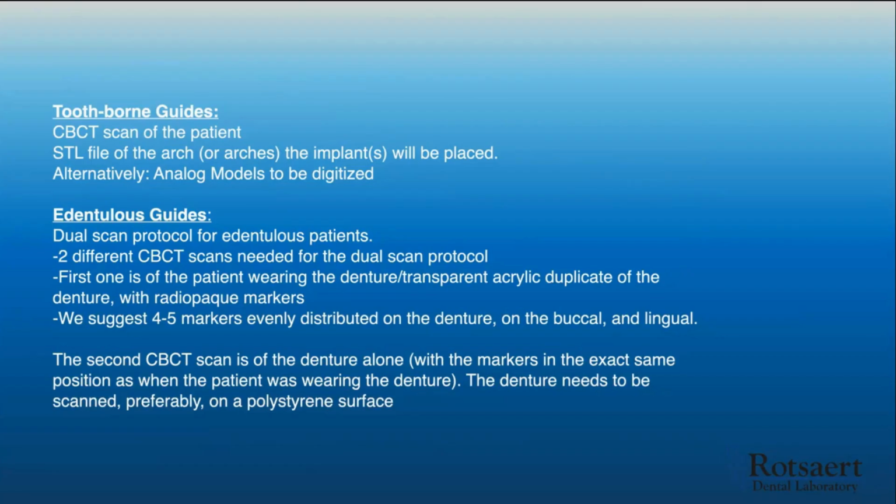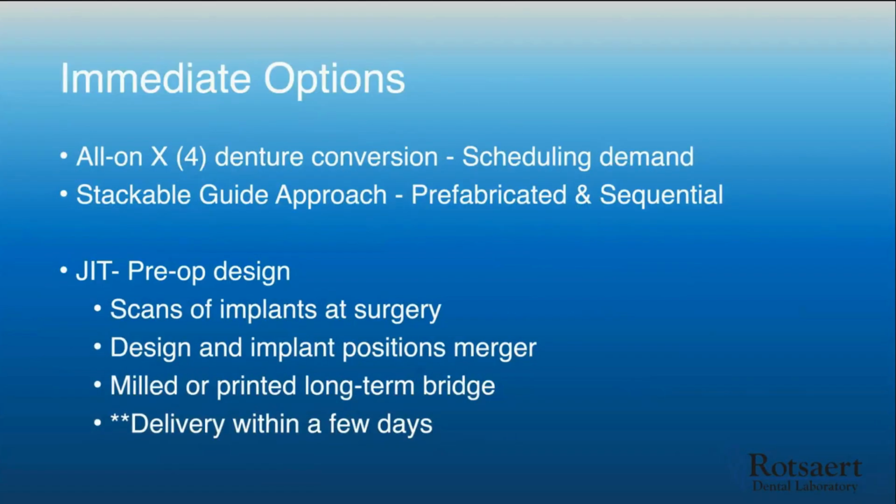And then when we look at the immediate approach, as I mentioned, all on X or all on 4, all on X is what every other company uses as a term. The concept is more of a treatment concept, more so than it is a sort of product, right? The thing to bear in mind is with any of these, it's a denture that's prefabricated.